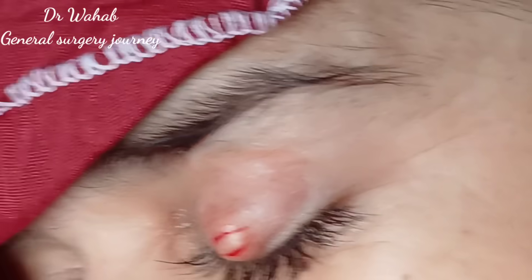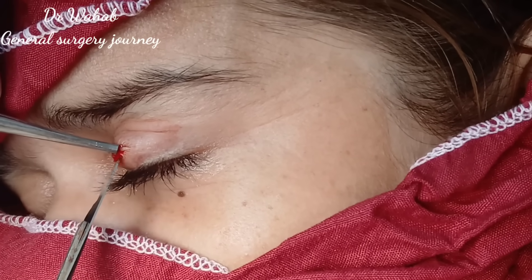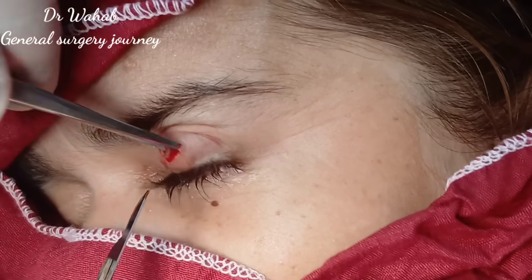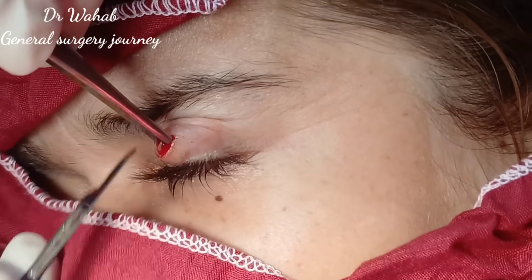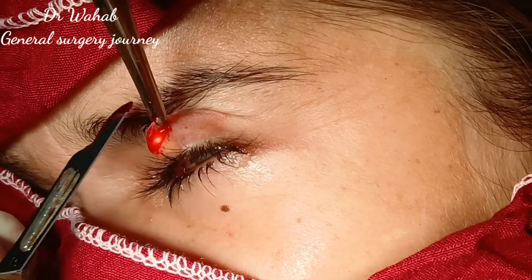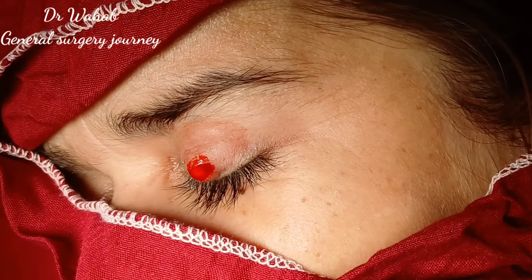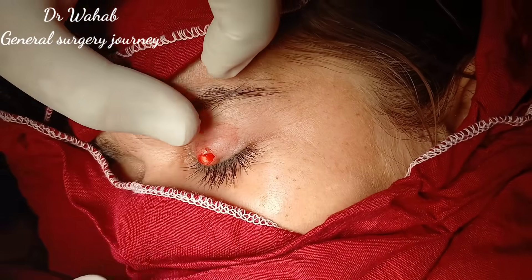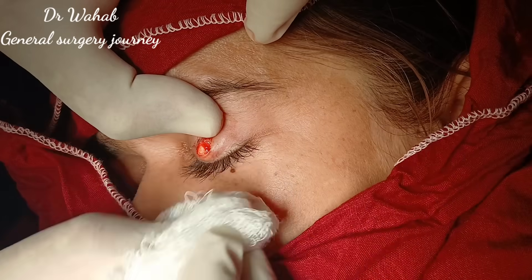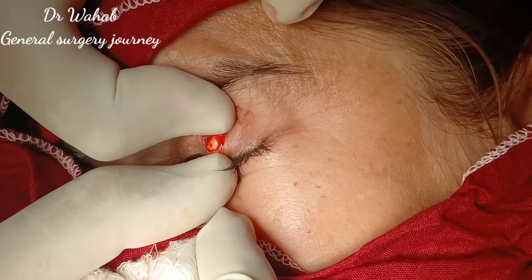Now we will do some sharp dissection with a scalpel to expose the cyst wall. Now we can see that the white capsule of the cyst is exposed. We will apply pressure with fingers.